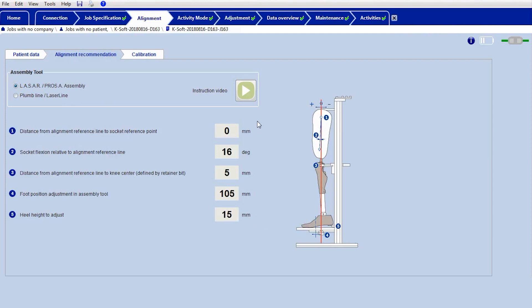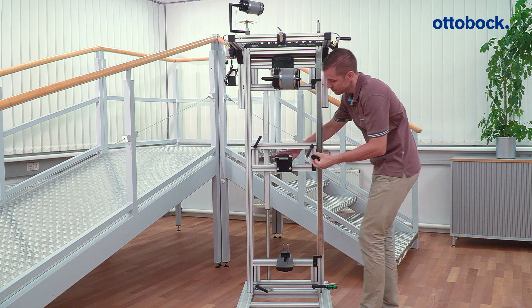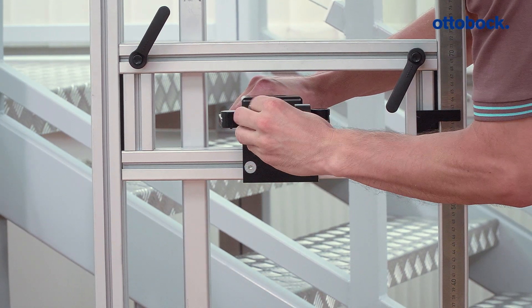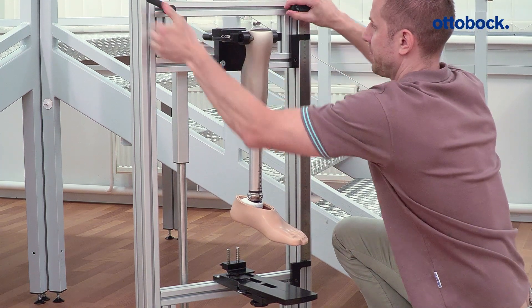Follow the alignment recommendation for the knee joint and the foot in K-Soft. Clamp the knee joint in the alignment tool using the adapter inserts specified by Ottobock and adjust the length according to the user's data.